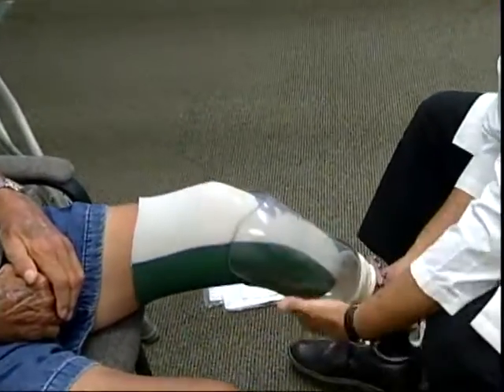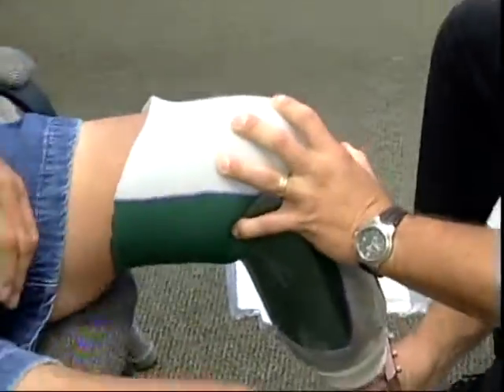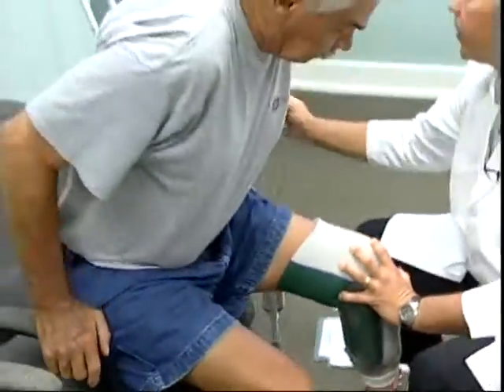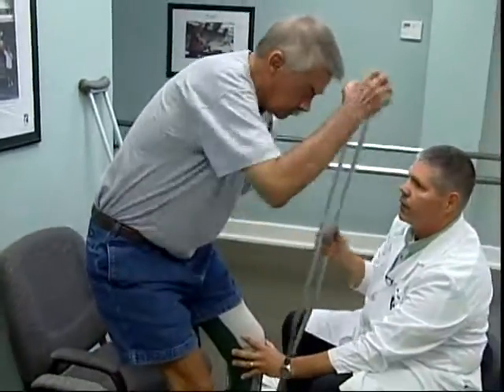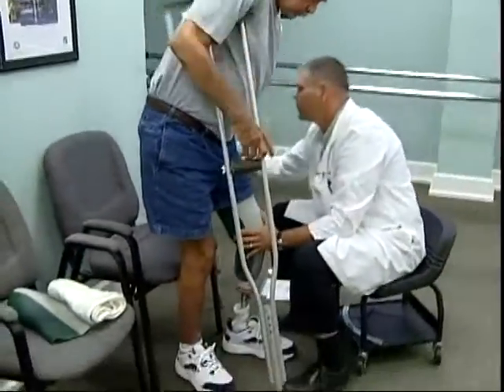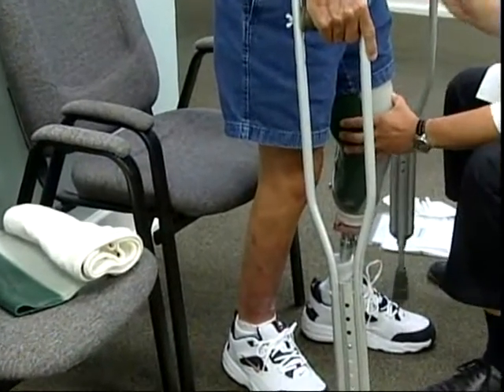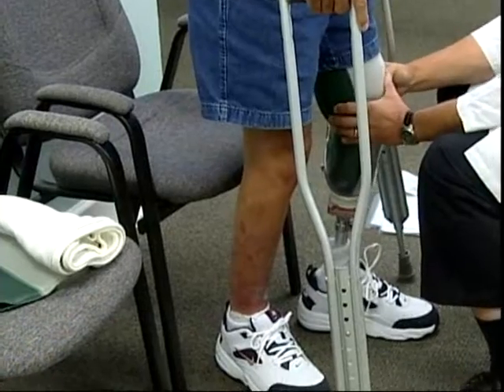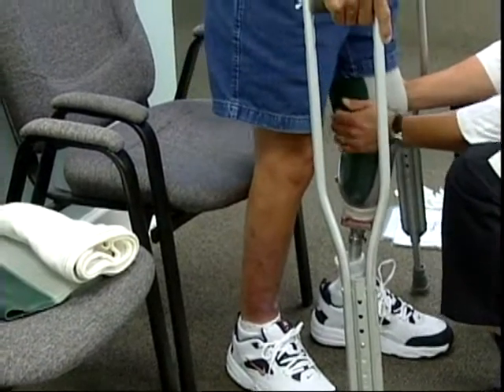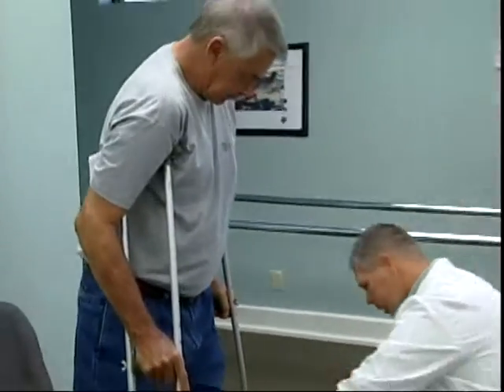And you hear the air, I can hear that, expelling out the back. Now I'm going to ask you to stand up for me. Give your crutch there. There's the second one. Hold on to that. Kind of feels 100% better. 100% better, and we haven't even turned it on. I turned it on. Okay, so I just want you to keep about half your weight down on there. We'll take a look at you.